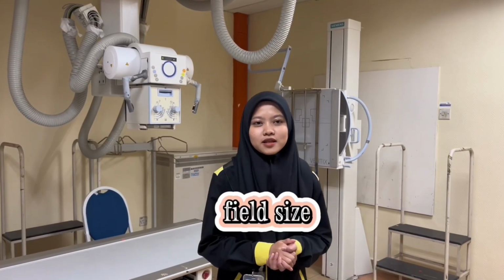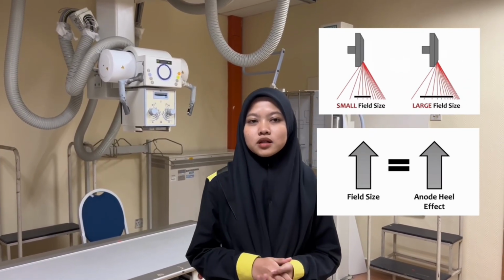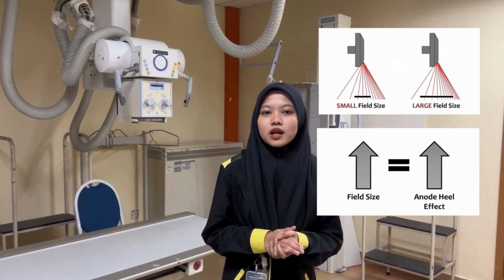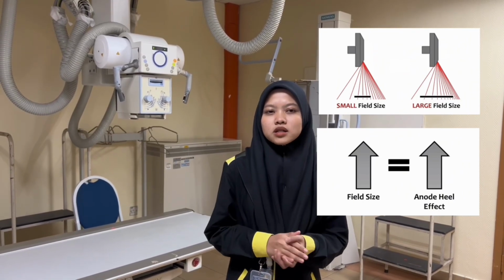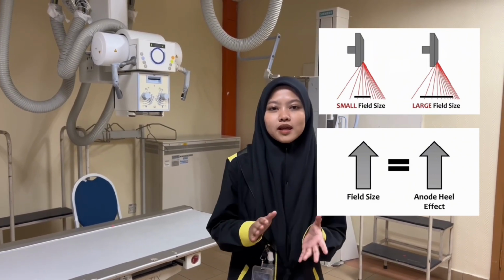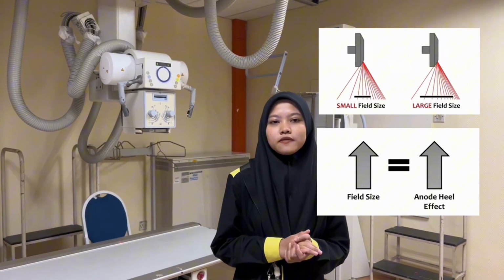Next, field size. In X-ray imaging, the anode heel effect can also be affected by the field size. Variation in X-ray intensity throughout the image may result from the anode heel effect being more noticeable when a larger field size is used. By removing X-rays from the anode and cathode sides of our field, a technique known as collimation, we can alter the size of our field. One advantage of field size that helps lessen the anode heel effect is collimation.